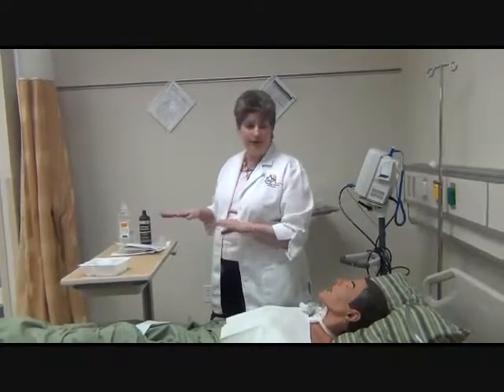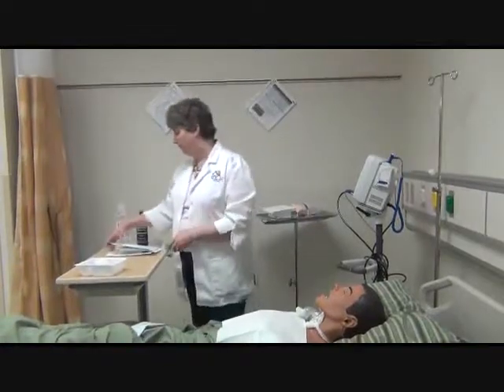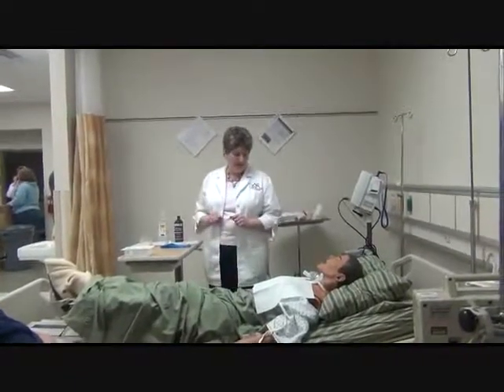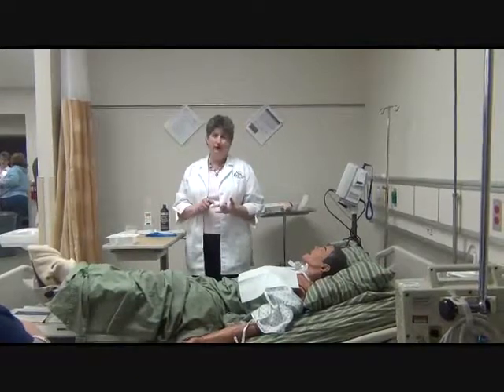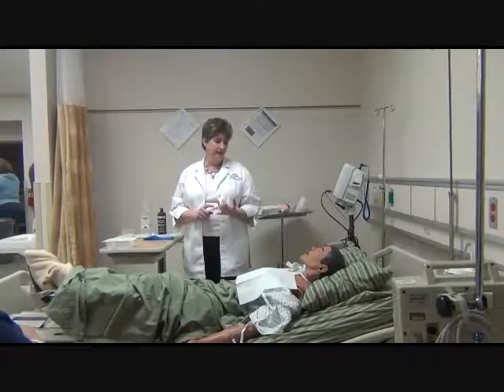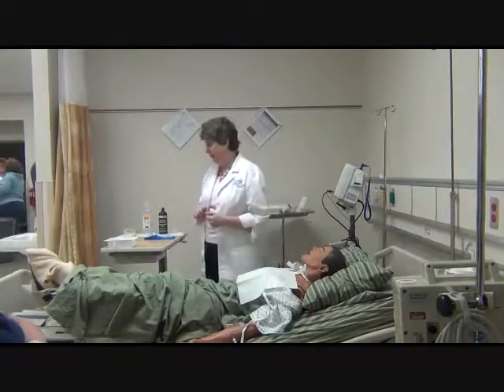I want to save the cleaning part until after I've established a good airway, so we're going to suction the patient before we do that. I've washed my hands and gotten a pair of regular non-sterile gloves. Now, when you do trach care, you don't always have to do suctioning. Some patients, if they are stable and have had a trach a long time, just need the cleaning. Other patients are also going to need suctioning, and again, your patient dictates what you do.